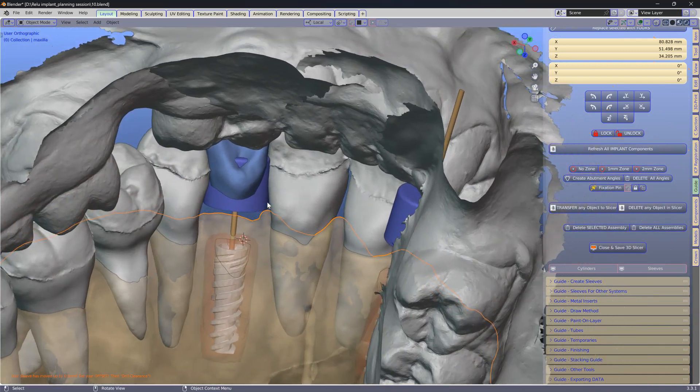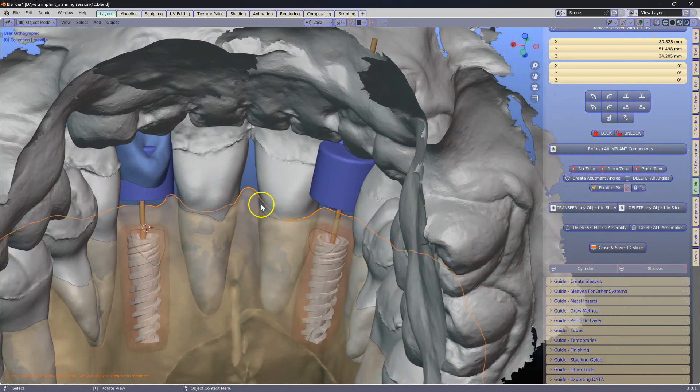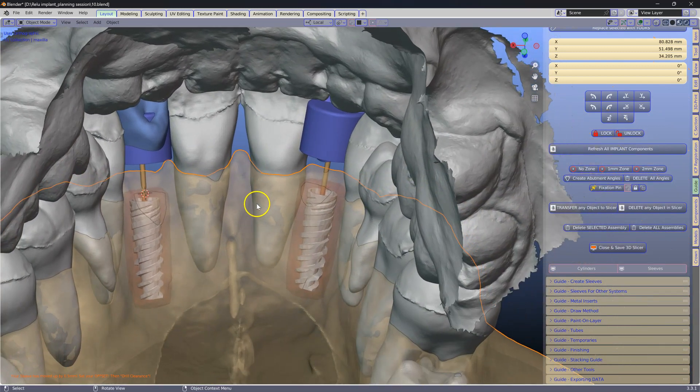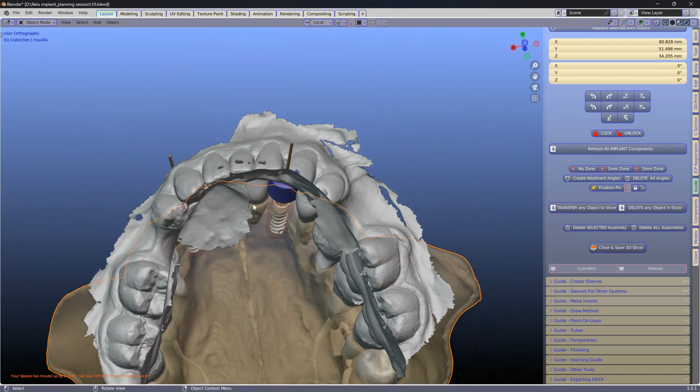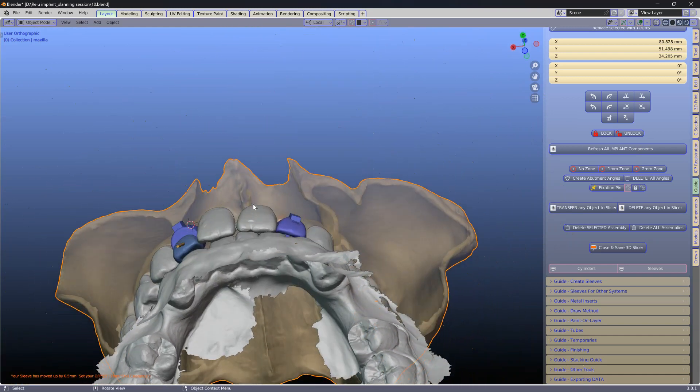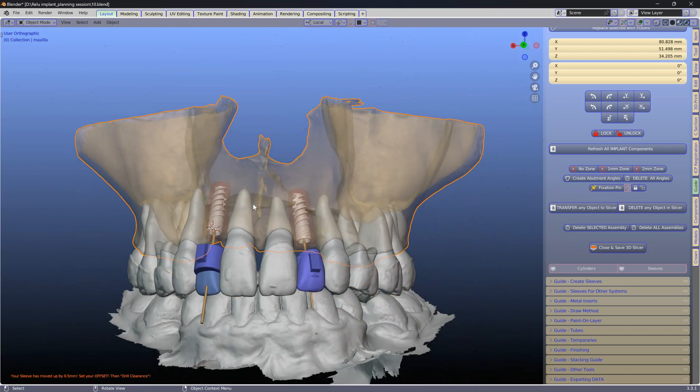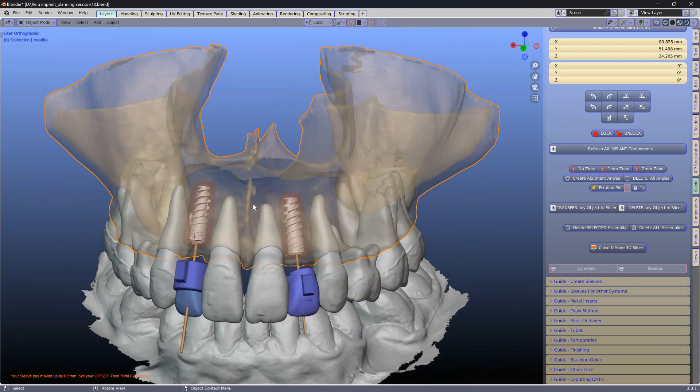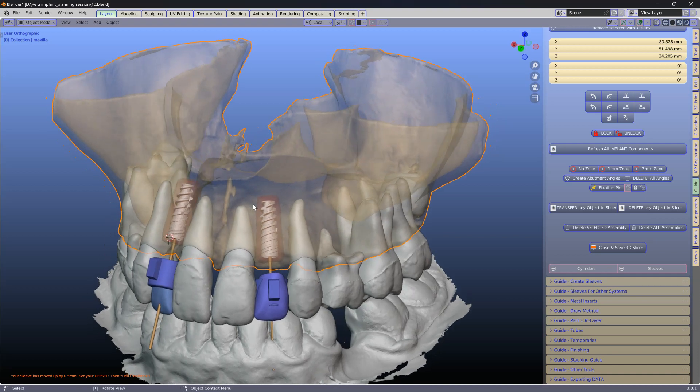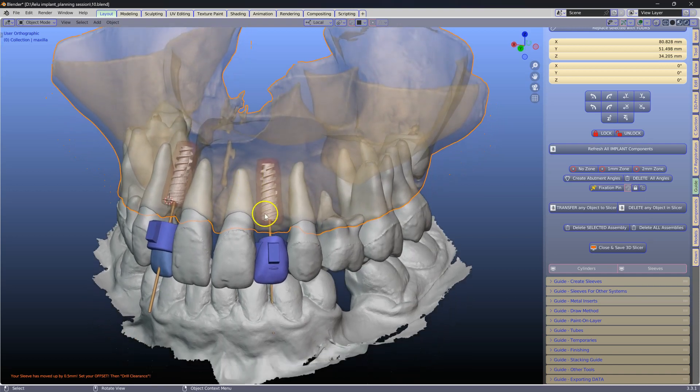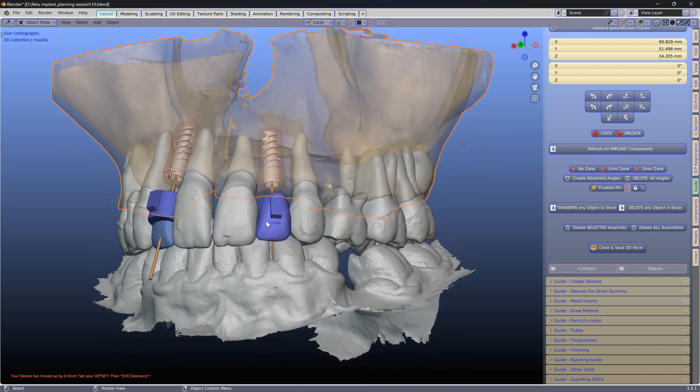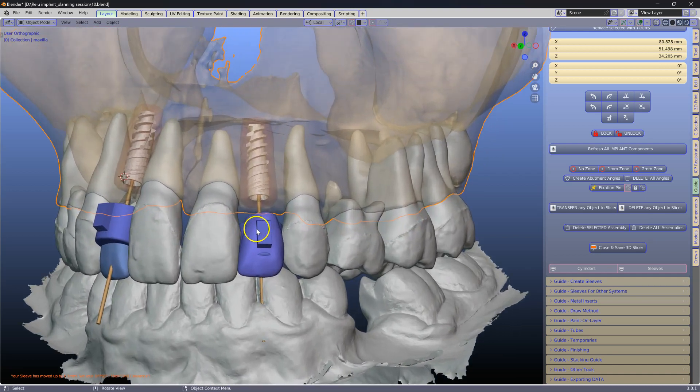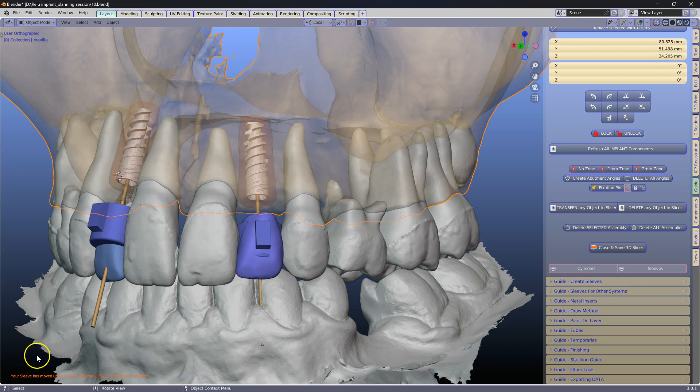Of course, this has to be confirmed with a CT Diacom scan, but once this is done and you are satisfied with the position of the implants, we will focus on making the sleeves.